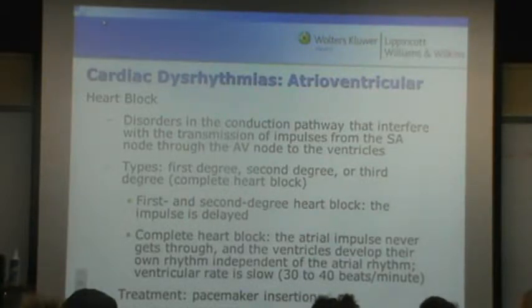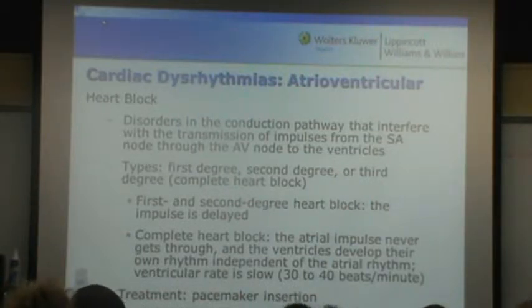We'll look at the regularity. Would you call that regular or irregular? Yeah, definitely. Can you predict the irregularity to it, where it's going to be irregular? Not really. All right. So that one, big thing: no P waves, irregularly irregular, and it's a narrow complex. That tells us what? Atrial fib. Yeah, so it's AFib.